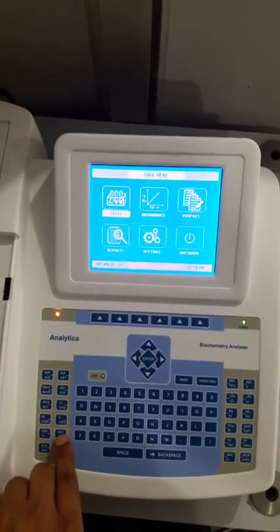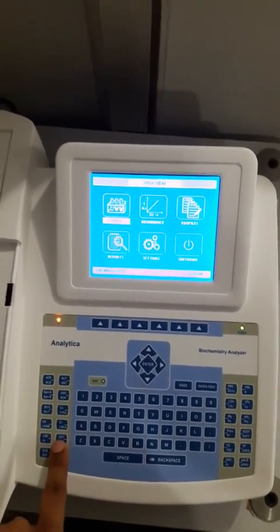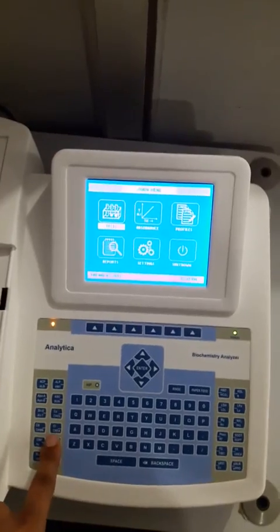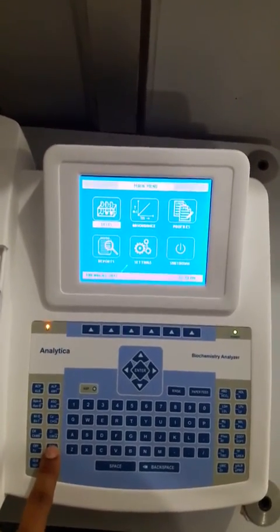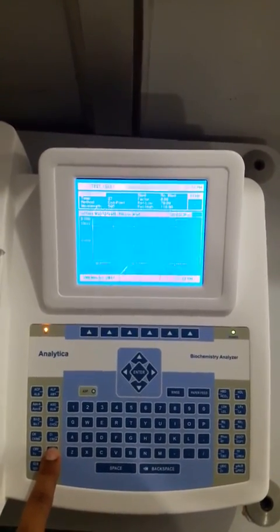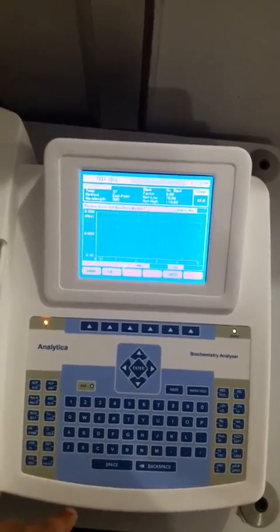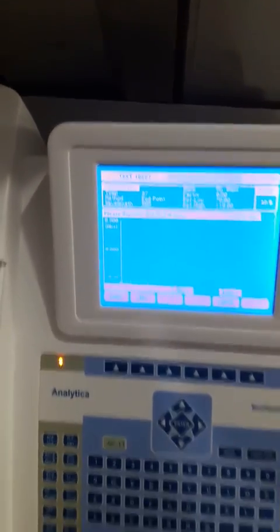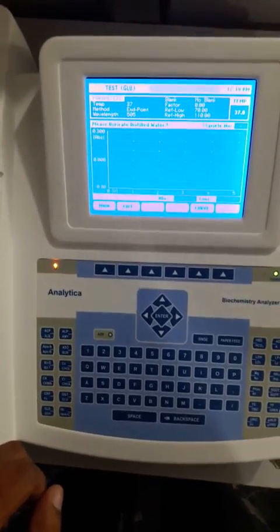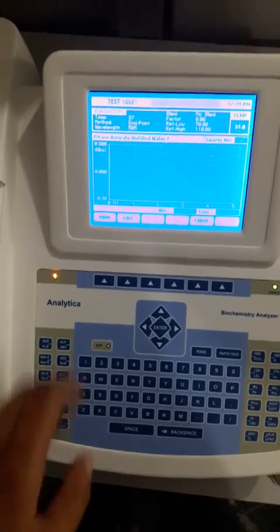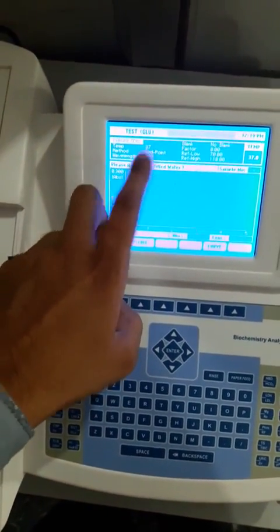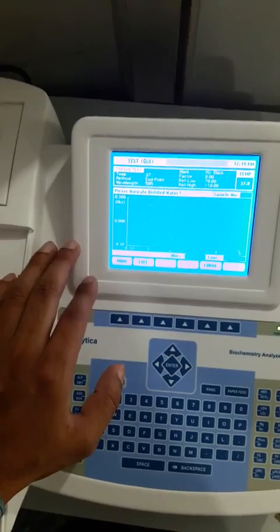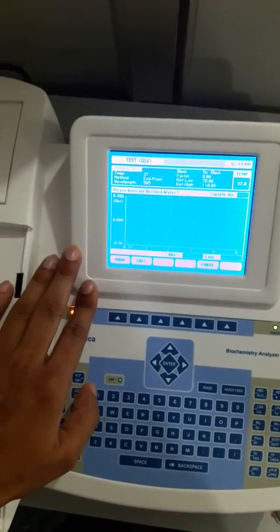Now we are going to perform the glucose test on this unit, so we have to press this key twice — or we can hold this key for more than one second. It will automatically select the lower test. I held this key for more than one second and now it has selected the glucose test. You can see the test name is showing with various parameters.